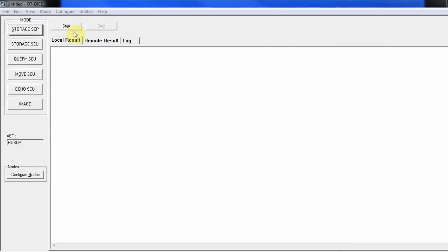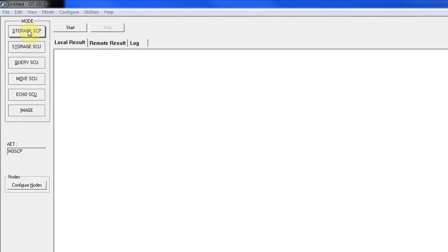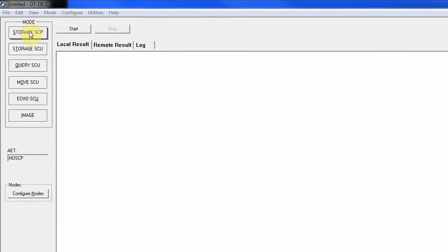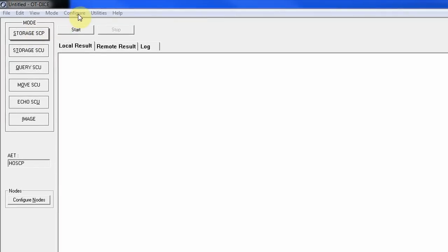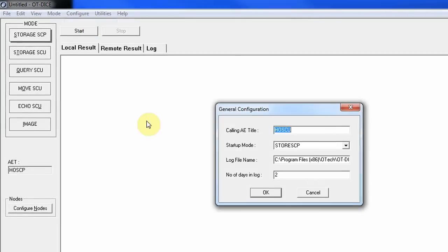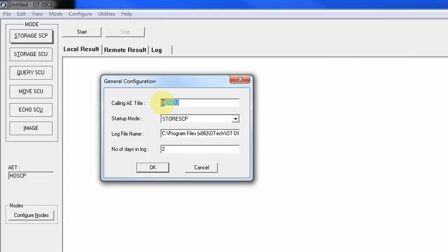After installing OT-DICE, you'll see the main screen with modes on the left. We're going to focus on the setup rather than the querying capabilities. The first configuration is the Calling AE title — in this case, I've named it HOSCU. This is the AE title used when this device communicates with another device.